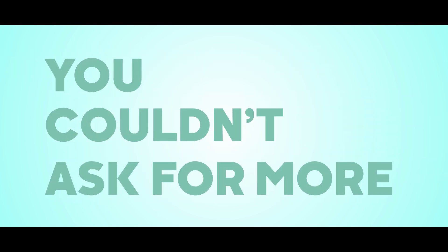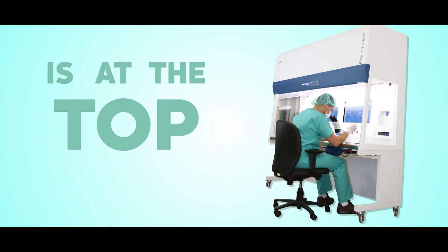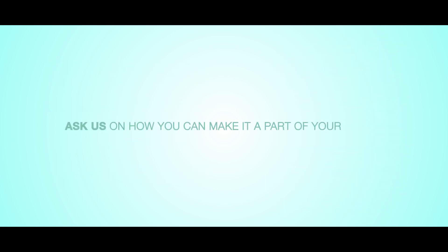You couldn't ask for more. Surely Fertilisafe is at the top of its class. Ask us how you can make it part of your IVF lab.